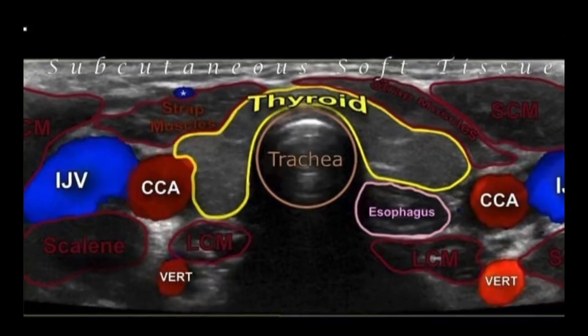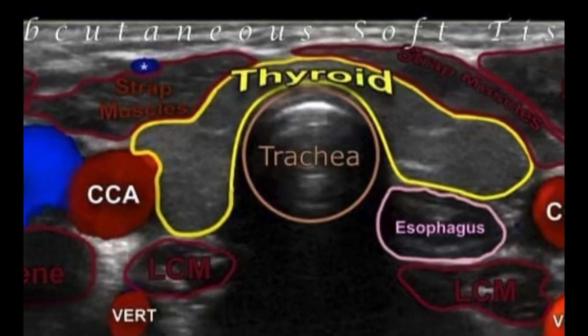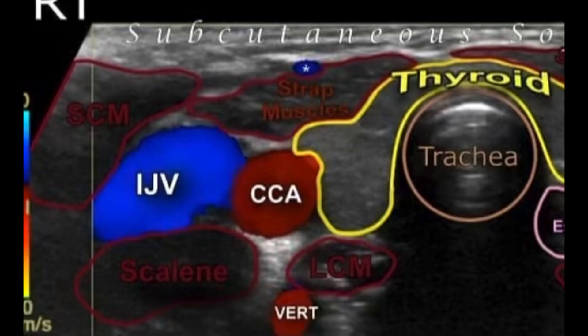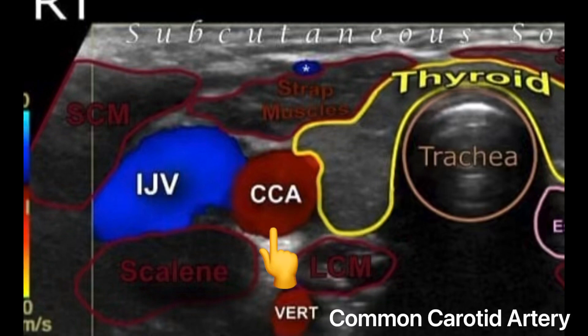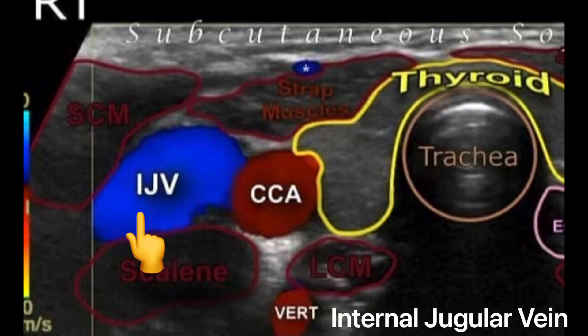Right directly posterior to the thyroid isthmus is the trachea. If we move on to the right side of the neck — which is the left side of the image — you'll notice a variety of blood vessels and muscles in anterior, lateral, and posterior positions. Let's go over the blood vessels first. Right lateral to the right thyroid lobe, you have the CCA, or common carotid artery. Anterolateral to that, you have the IJV, or the internal jugular vein.